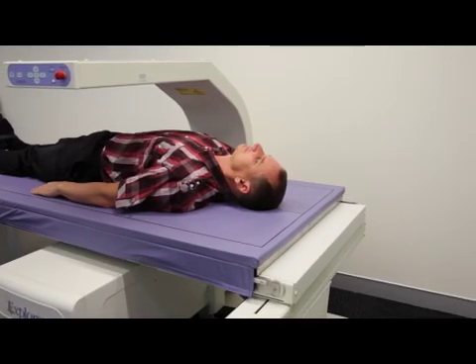muscle, bone, and fat tissue. And it measures those tissues down to one-tenth of a gram.